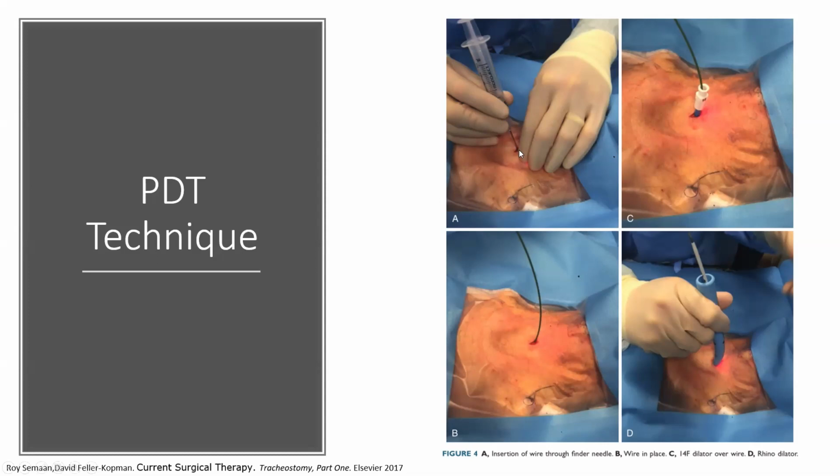Now, the best way to ensure that is to bronchoscopically visualize the location of the needle. Before you even do that, what we often do is start the bronchoscopy and clear out any secretions. Then we park the bronchoscope at the end of the ET tube, deflate the balloon, retract the tube into the subglottic space, and inflate the balloon to achieve occlusion, providing a view of the subglottic space and the first to fifth tracheal rings. Once you cannulate the second and third ring with a needle, there are two ways to do this. You can hold the needle directly, or you can hold a syringe like you do a central line, for example, apply a vacuum against the plunger, and once you get in and lose resistance, you know for sure that you have achieved cannulation of an air space, rather than a vessel or a mediastinal space.